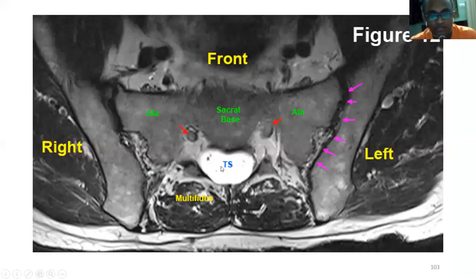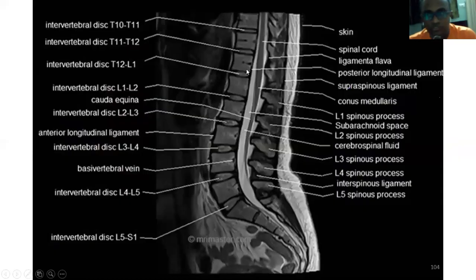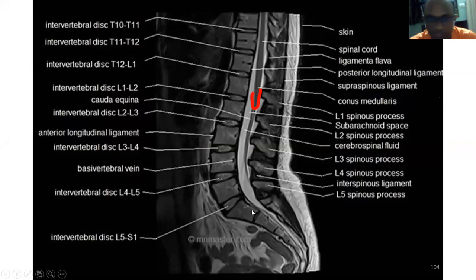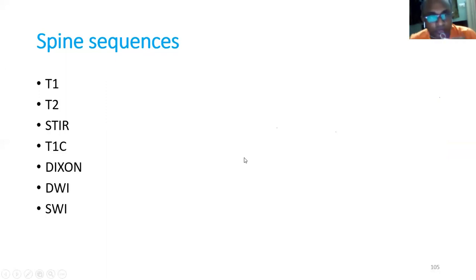In the sacral region on axial view, you can see the spinal canal with the cauda equina appearing bright, the ala, iliosacral junction, right and left sides, sacral base, and sacral promontory. On sagittal image you see the vertebral bodies, disc spaces, conus medullaris (where the spinal cord ends), and the cauda equina nerve fibers below. Spine MRI sequences available include T1, T2, STIR, T1 contrast, Dixon, diffusion-weighted imaging, and susceptibility-weighted imaging.